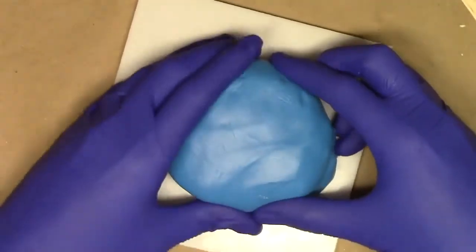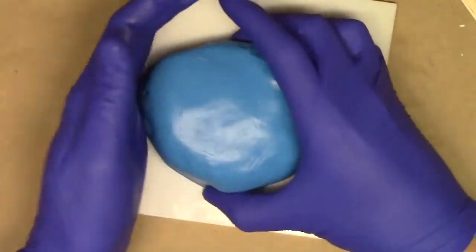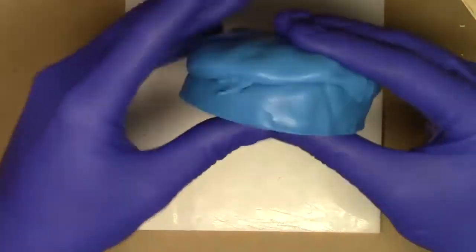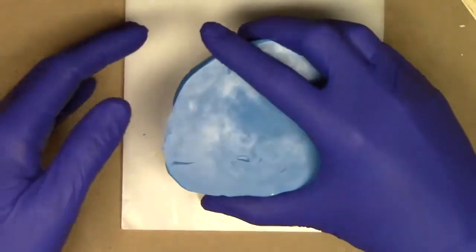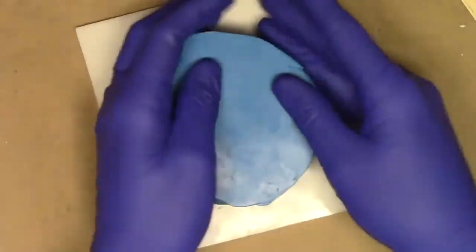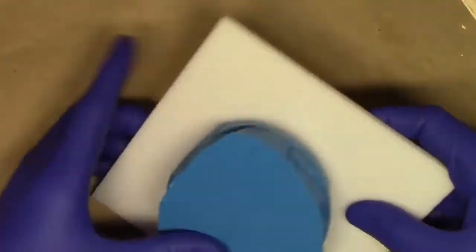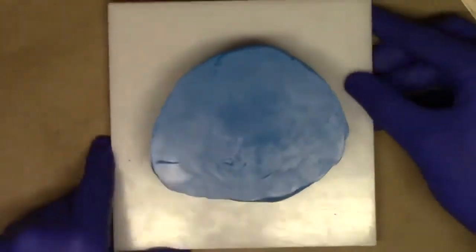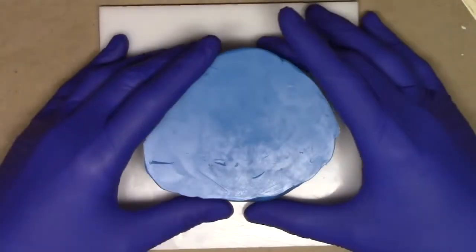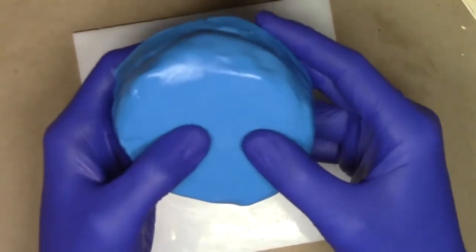and then pushing pretty firm so that way the top part of this putty is fully down over the edges, just like so. Sometimes what I do is I bunch it up to the side and flip it upside down and push in that position, giving me that appearance. And I let this set for a few moments. After it's been a few minutes, we can go ahead and verify that the putty has been completely set.